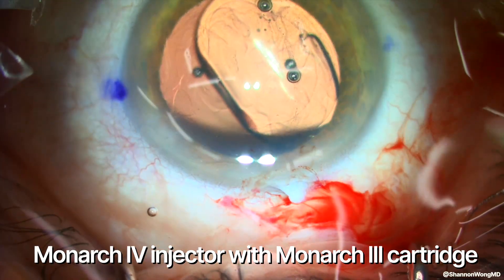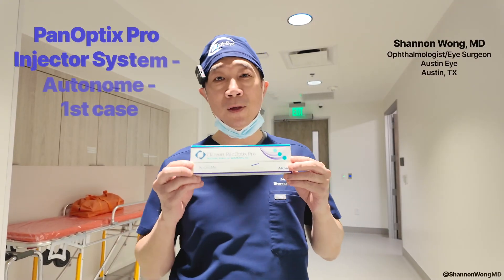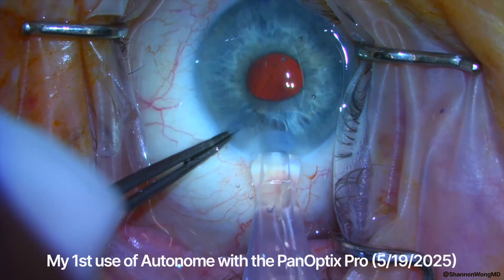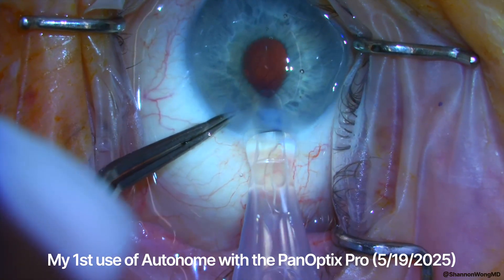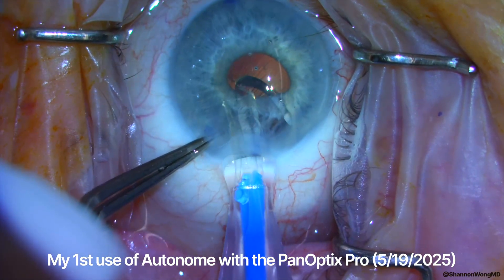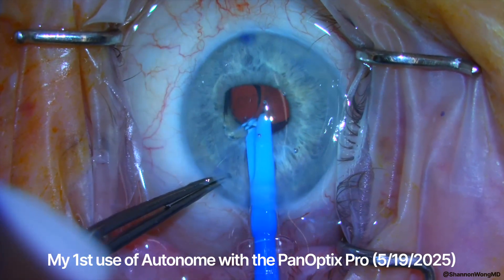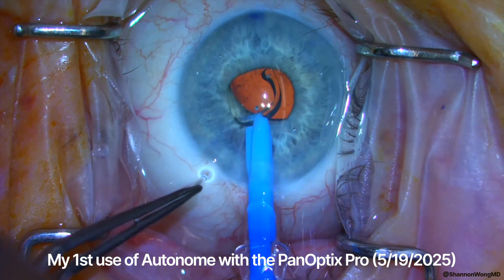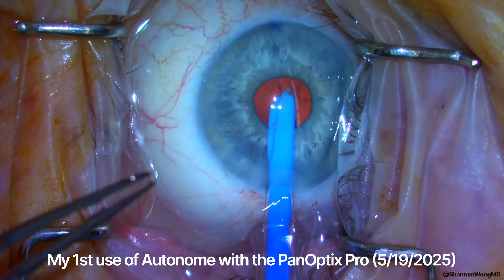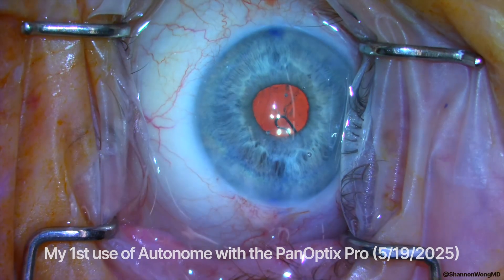Now let's talk about the autonomy insertion system. On May 28th, I posted a how-to video on the autonomy insertion system. Note that the leading haptic enters the eye in an S configuration, which is actually incorrect. The haptic then rolls off the iris and moves into the preferred backward-esque configuration in the capsular bag.